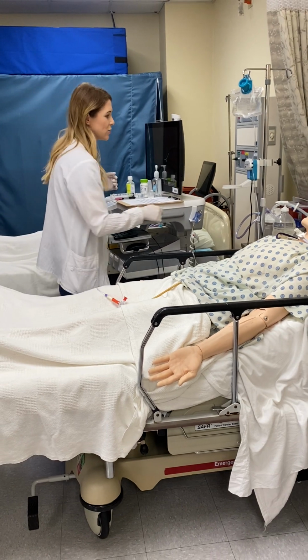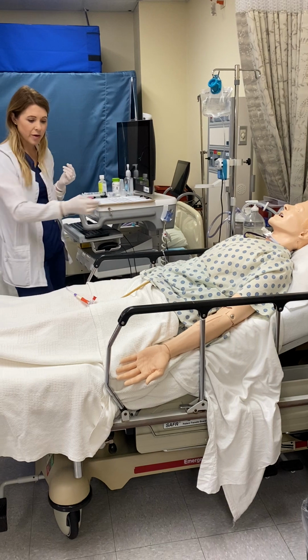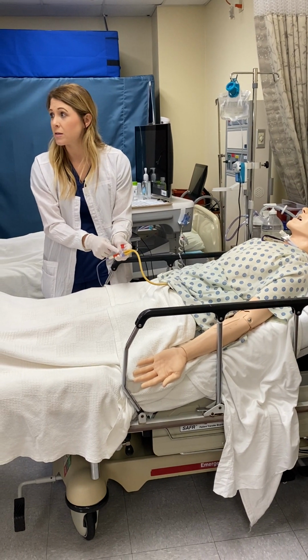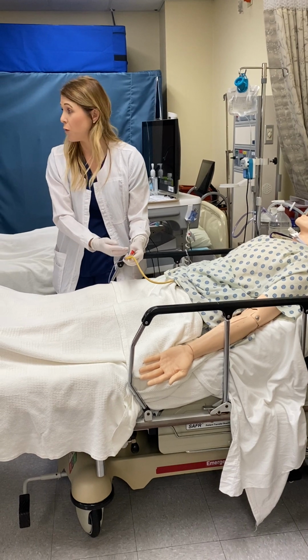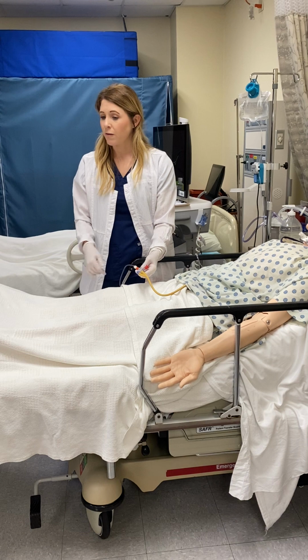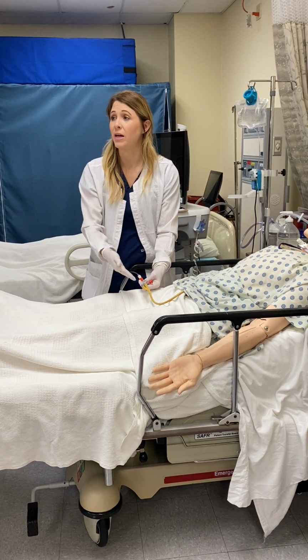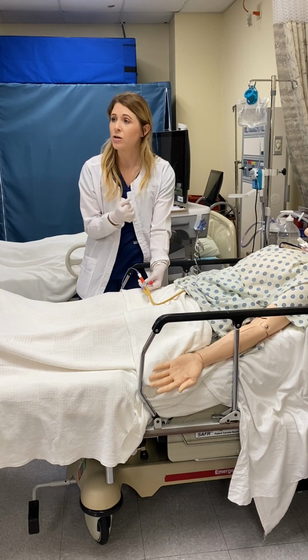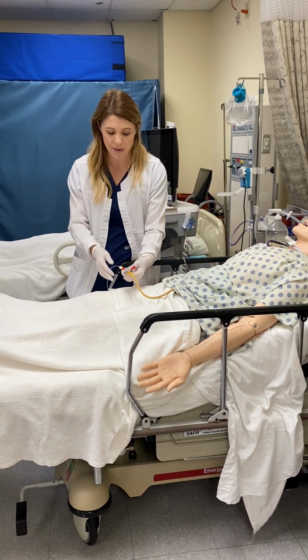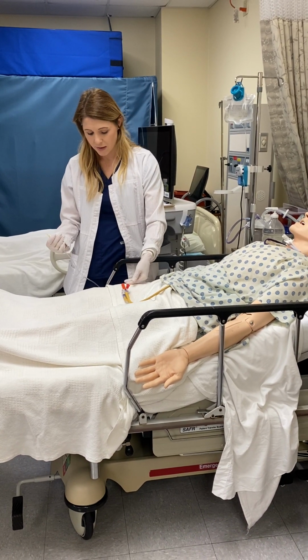So for that, I do need to stop your feeding, so I'm just going to hit pause on those. Some of them also have these stopcocks, so you can see where the arrows go and it's open so the feeding can go forward. But anytime I disconnect the feeding or I'm going to open the PEG tube, I need to turn it off toward the patient. If he coughs, sneezes, turns the wrong way, feeding or formula or stomach contents comes out of there, okay? So I'm going to turn it off to him, and I'm going to take his feeding off this away.